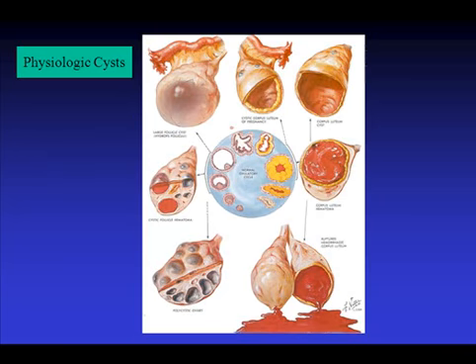This Netter diagram shows the group of cystic lesions that we can study using sonography, and depending on where the ovulatory disorder occurs, we can have a follicular cyst or a corpus luteum or a luteal cyst if the hemorrhage has undergone fibrinolysis, for example.